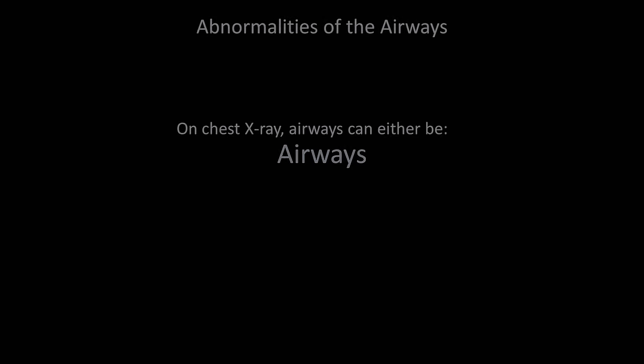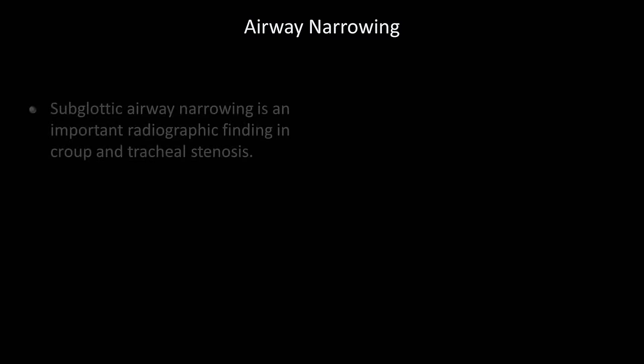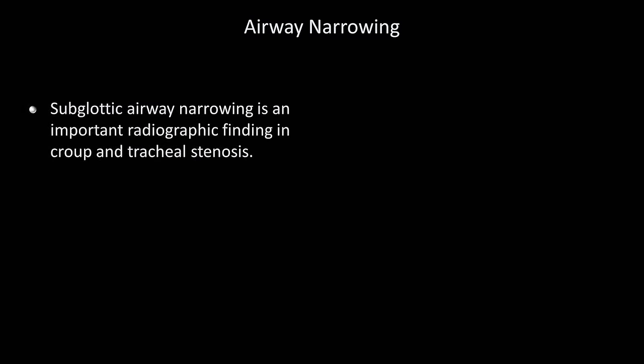Let's start with the airways. On the chest x-ray, the airways can either be narrowed, deviated, or on occasion, contain foreign objects. There isn't much to say about airway narrowing other than the fact that subglottic airway narrowing is an important radiographic finding in croup and tracheal stenosis.